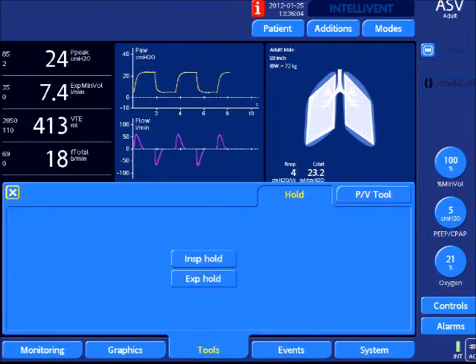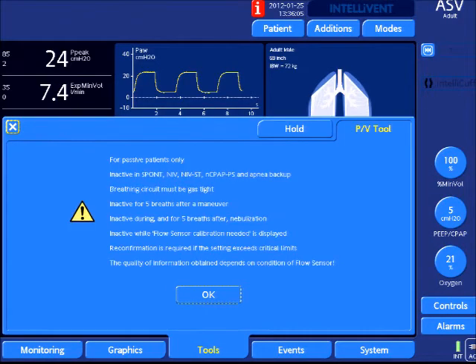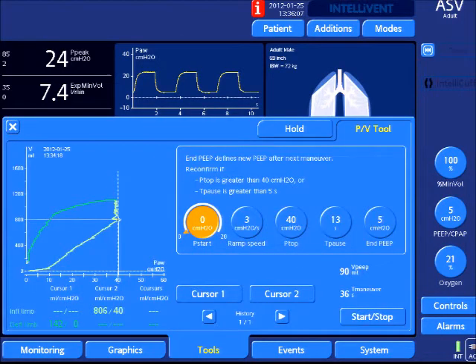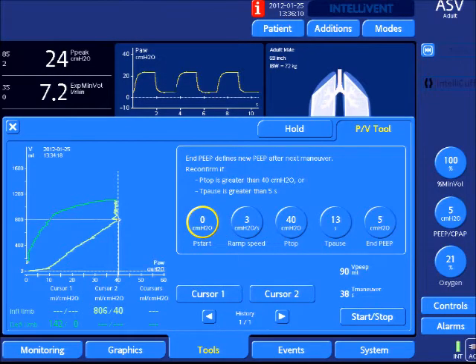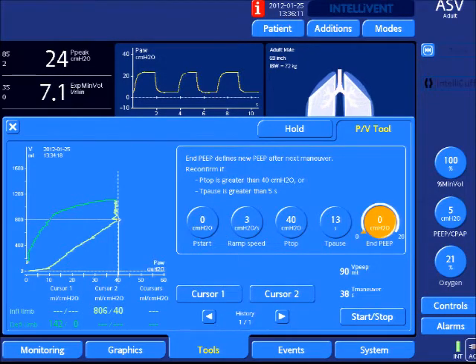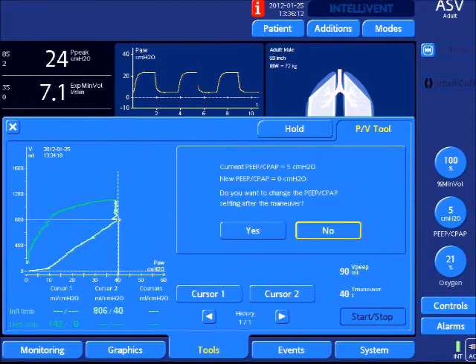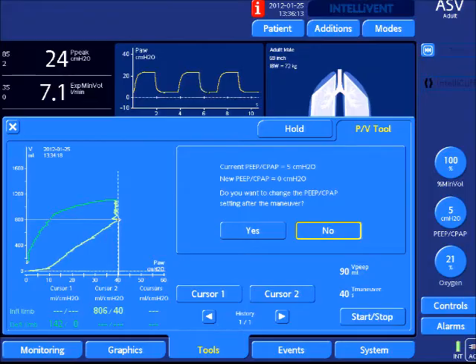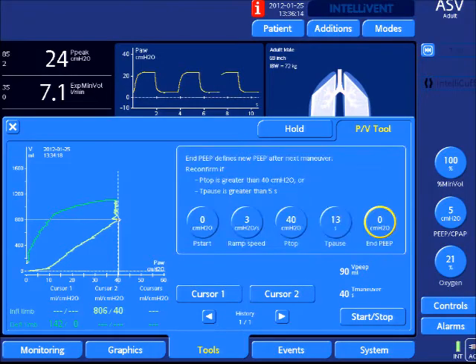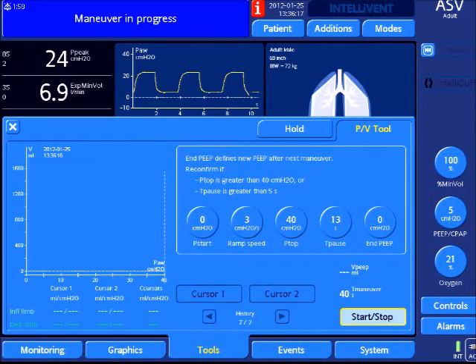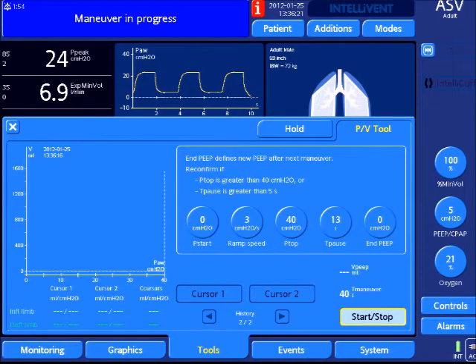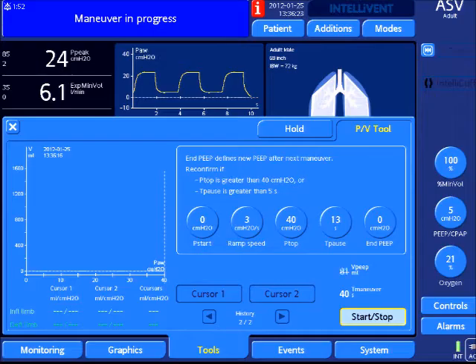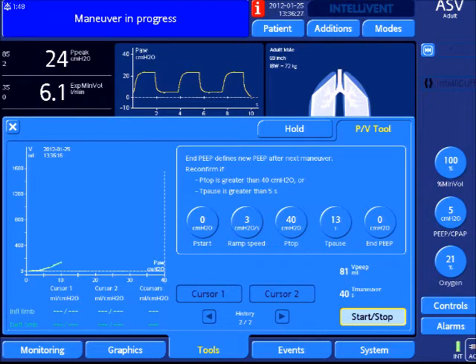This first video demonstrates the analysis of the pressure volume curve and the PV tool in use. This is going to show a non-recruitable lung. A pause of 13 seconds is used as a recruitment maneuver.